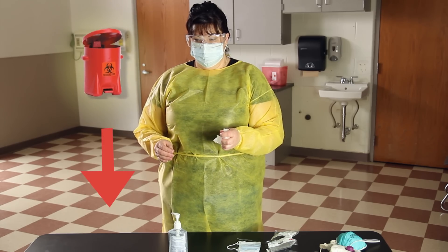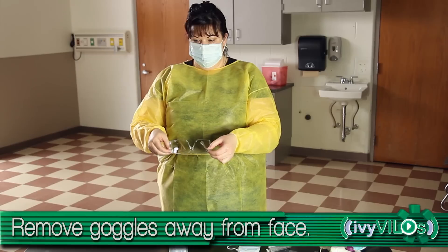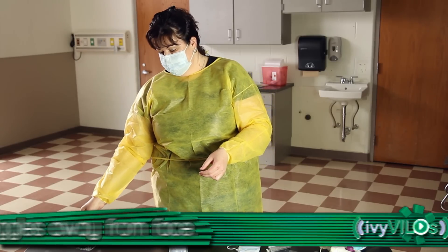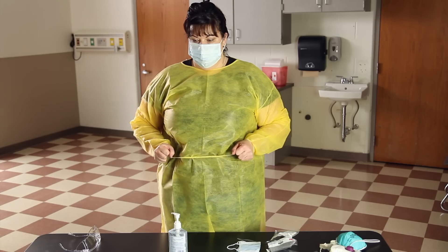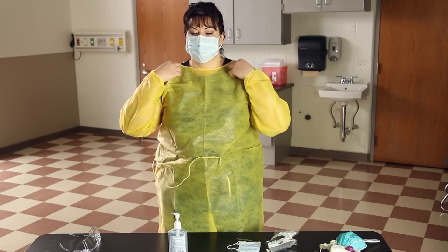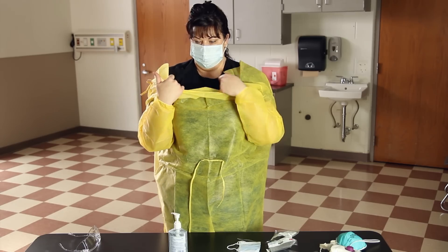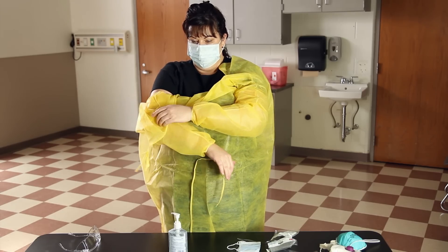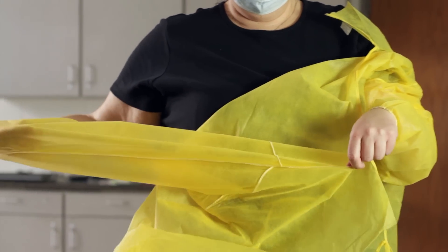Discard in the appropriate receptacle. Remove goggles by headband or ear pieces and lift away from the face. Remove the gown by unfastening ties at waist and neck. Pull the gown away from the shoulders, torso, and arms by only touching the inside of the gown.